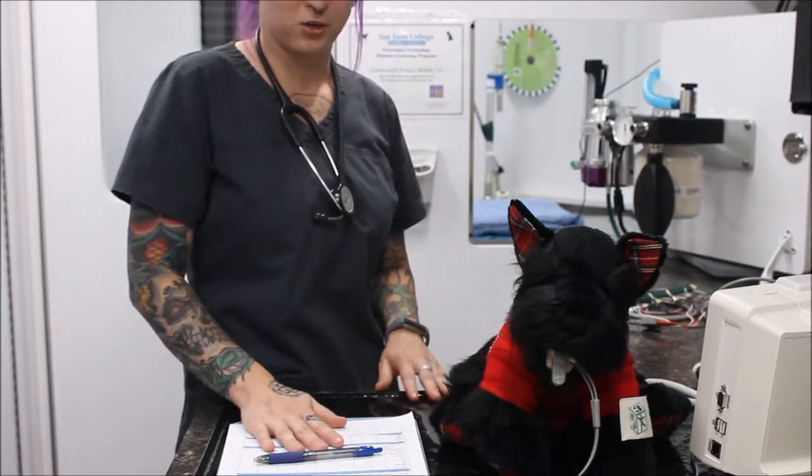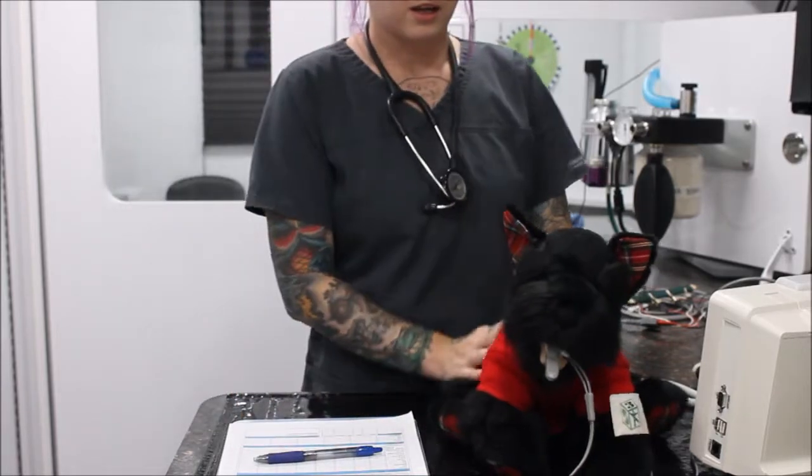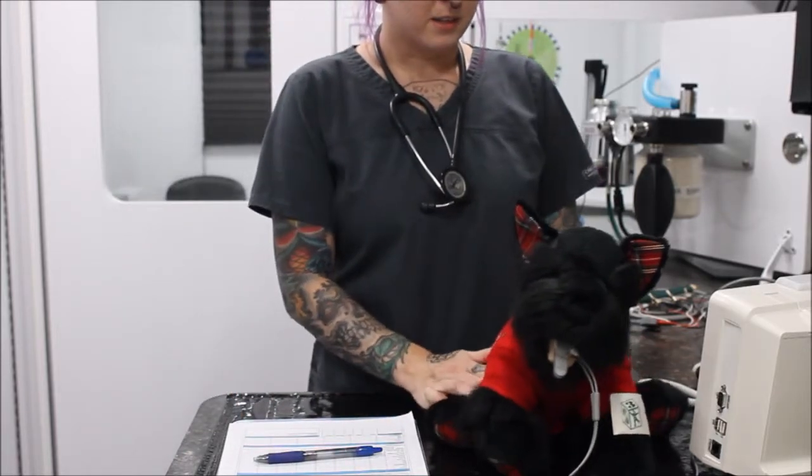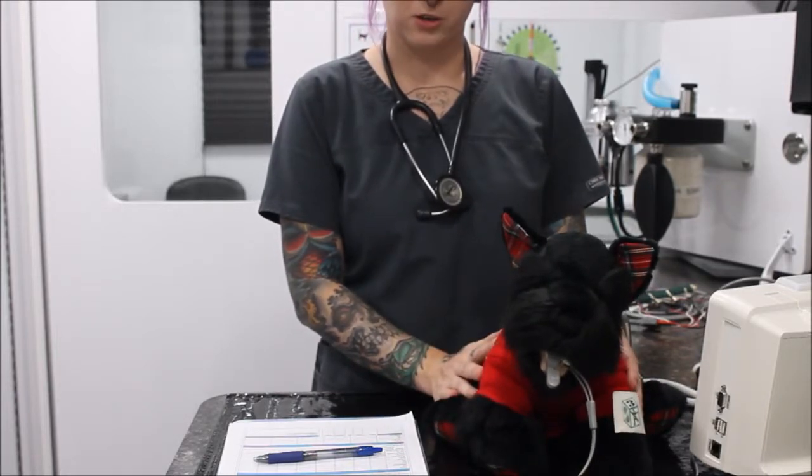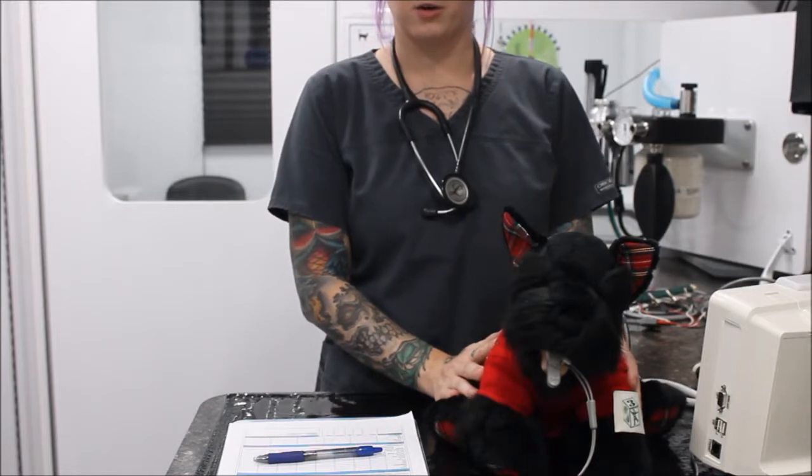It's really important to make sure that we record everything. And that is it for determining our physiological status, and then we'll go and talk about reflexes.